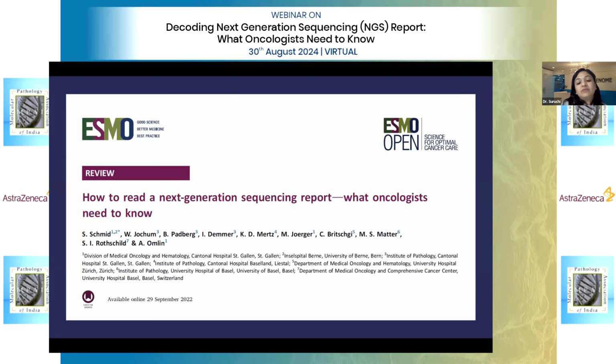And that also, sometimes if you don't have a good quality FFPE DNA, you cannot have 1 MB complete coverage. So while determining the TMB, even if you are running a 400 gene panel, the quality of the data has to be looked upon very carefully, whether we are covering the whole 1 MB and the coverage is good or not, because FFPE will have that challenge. So TMB will not be determined accurately. If the coverage is low and mutations are high, then TMB will be erroneously high.